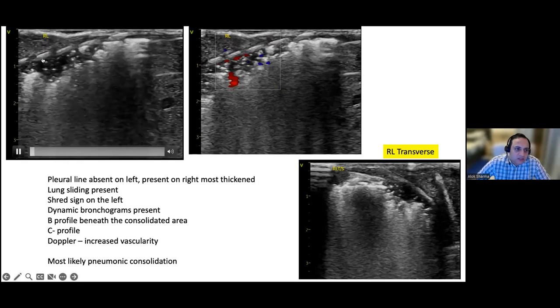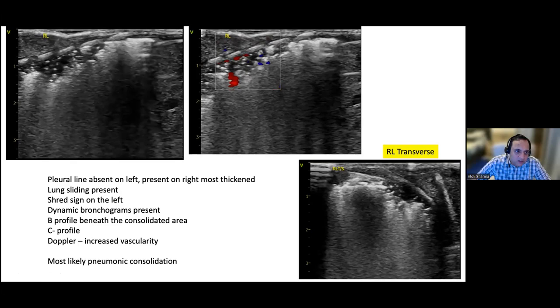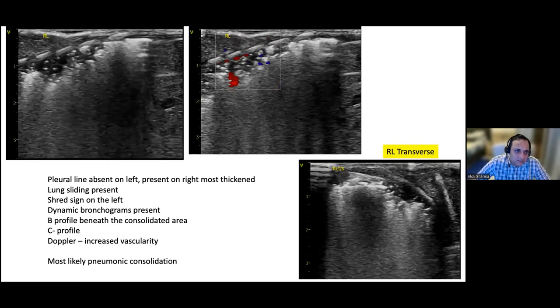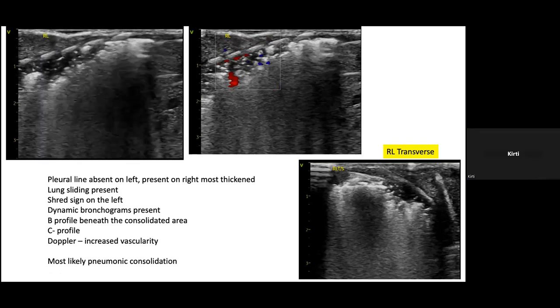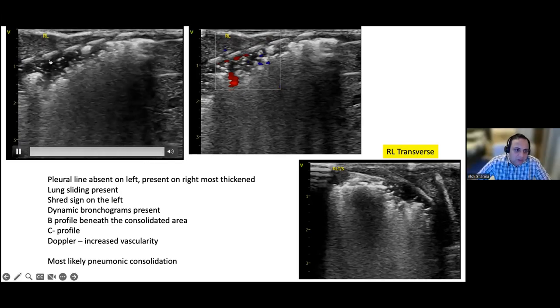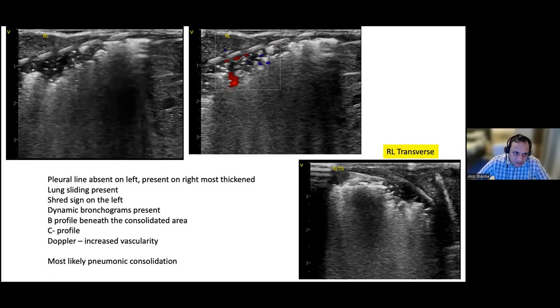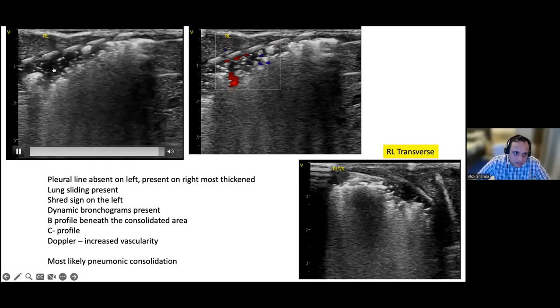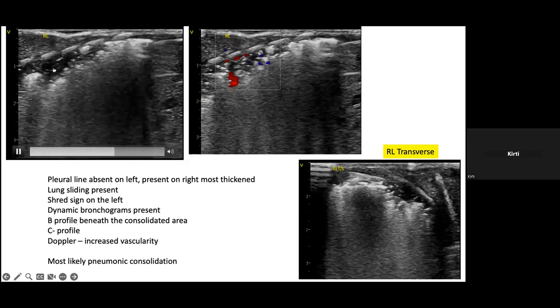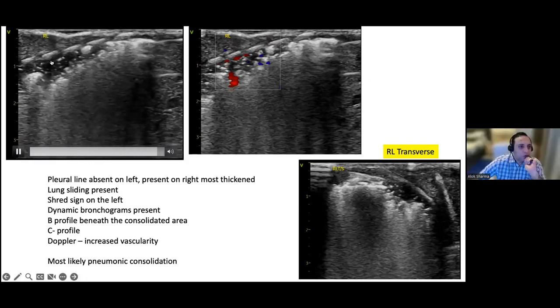Okay. Now what you can see is static air bronchograms below, but the dynamic air bronchograms are just below the rib. Can you see that? The ones that fade in and out. Yeah, they are dynamic bronchograms. This one. Yes. But the ones below that are static, just remember. Okay, just so everybody is able to see, show everybody the dynamic bronchograms, please. Yeah, beautiful, those ones there.